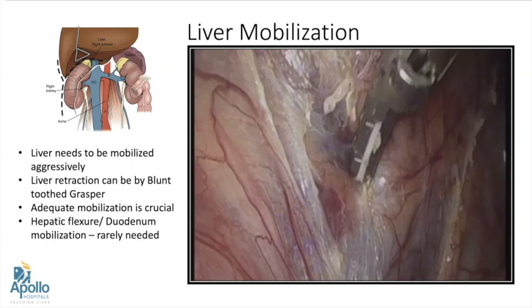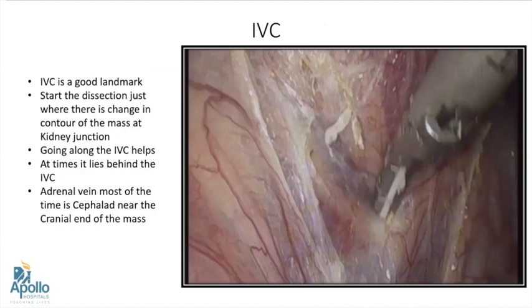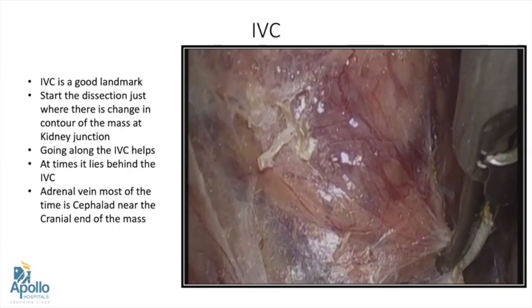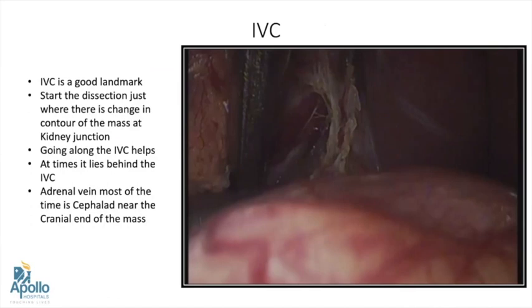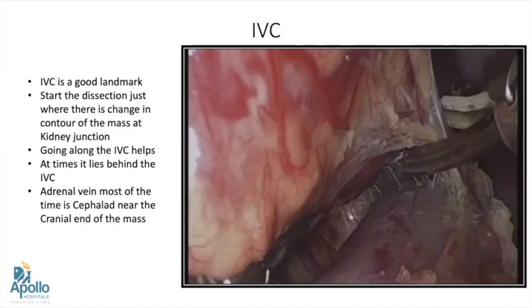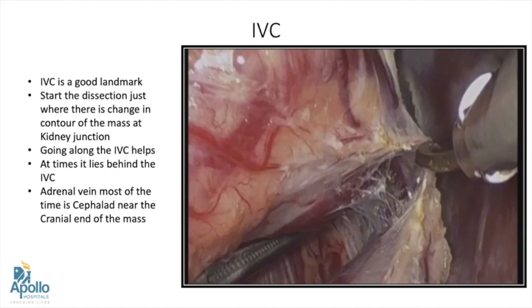We don't have to mobilize the hepatic flexure and duodenum in case of right adrenalectomy most of the time. The next step in right adrenalectomy is identification of the IVC. The IVC acts as a very good landmark. We should start our dissection where the contour changes. Once we see the IVC, we can ascend up along it. At times, we may need to push the IVC medially and push the mass to see the vessels which lie behind.